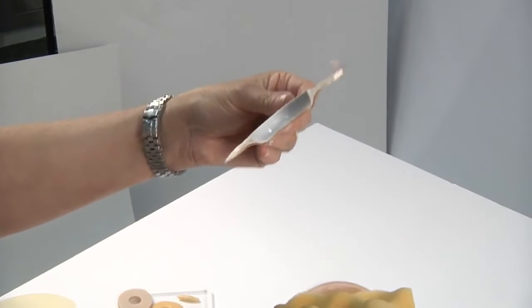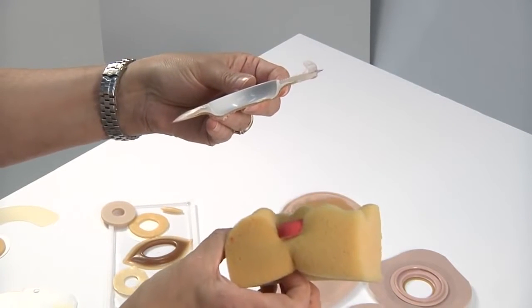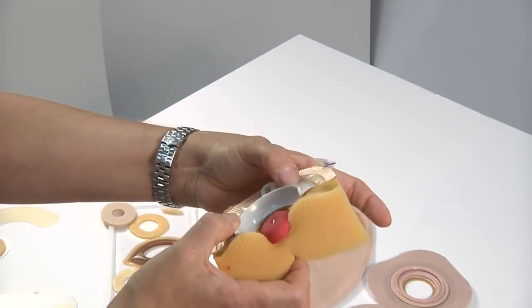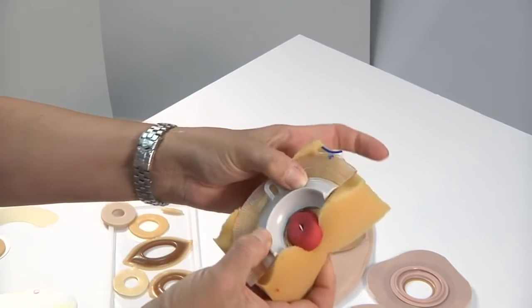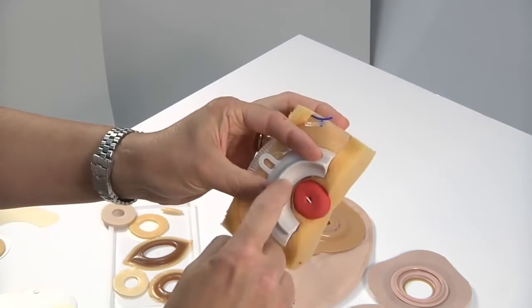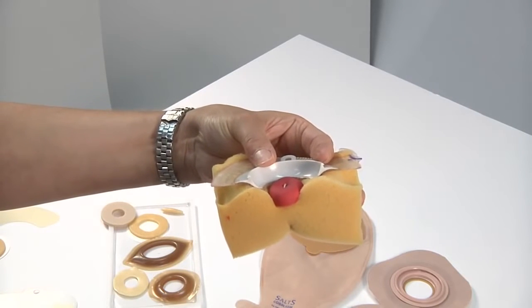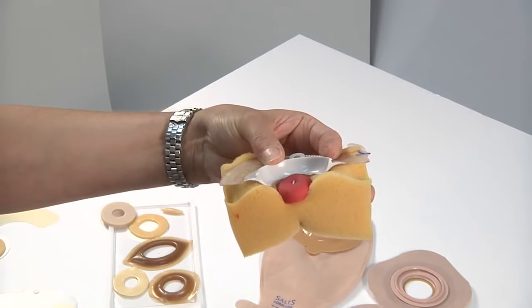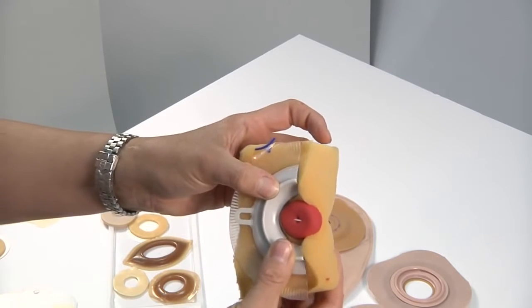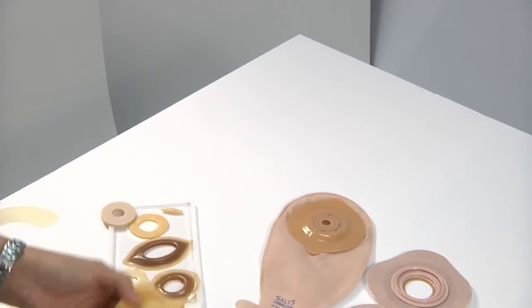And if we take that example of this great looking stoma but not so great looking peristomal plane, when you apply the convexity, you can see as it pushes into the skin that it's flattened out that plane, and you're now not exposing or seeing the skin, and you're not going to worry about the stool or the urine seeping underneath and causing a leak. So that's what convexity does. It's actually going to distort that plane or fill in that plane for you so that you have a better seal.